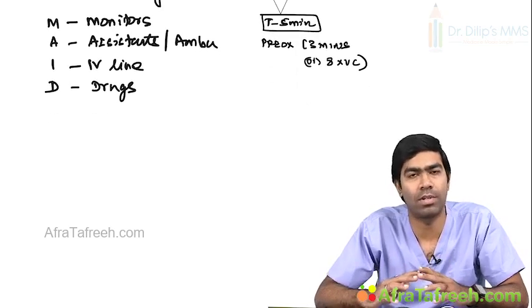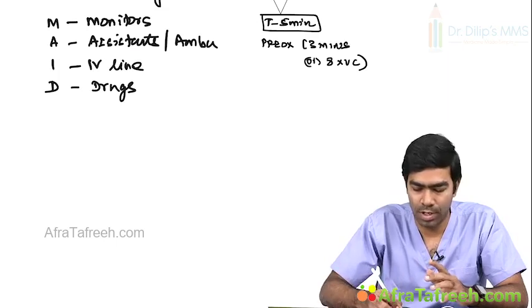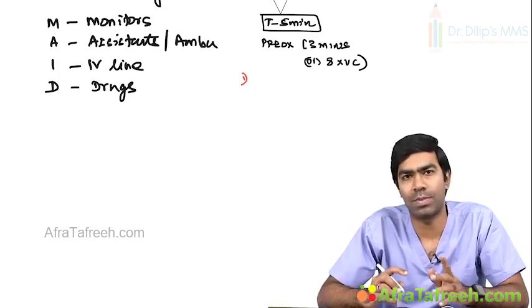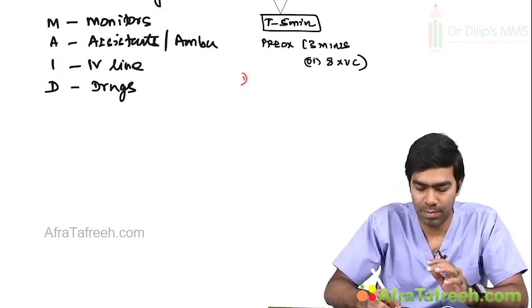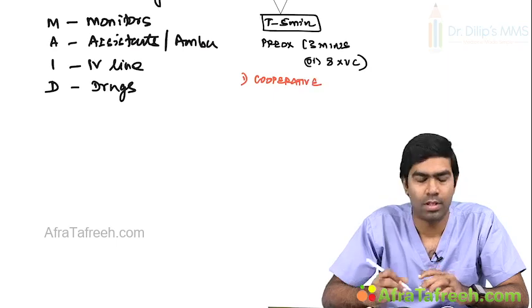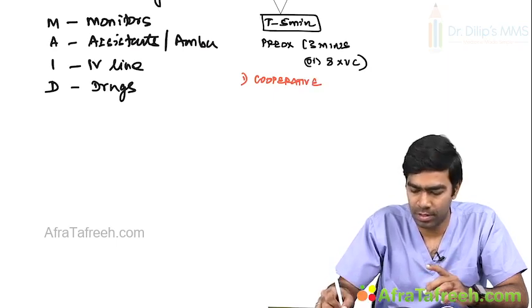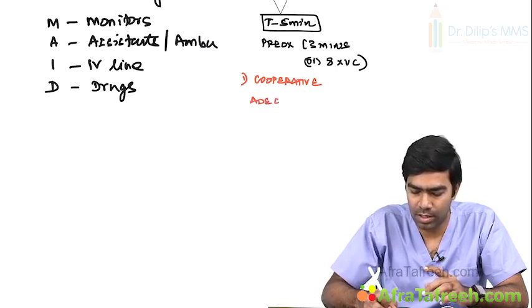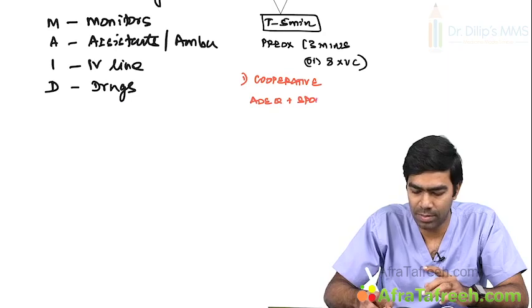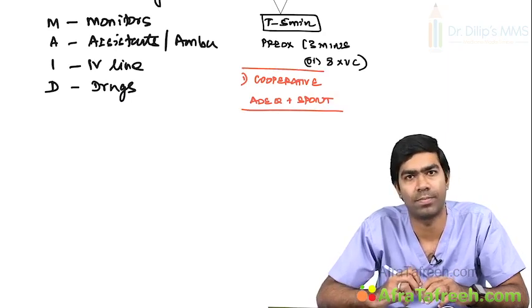Okay, you have given the pre-ox. What are the ways to give the pre-oxygenation? So there are some ways depending on the patient profile. Let us assume the first patient, which is the most common type, where the patient will be extremely cooperative. At the same time, patient will be having adequate and spontaneous ventilation.